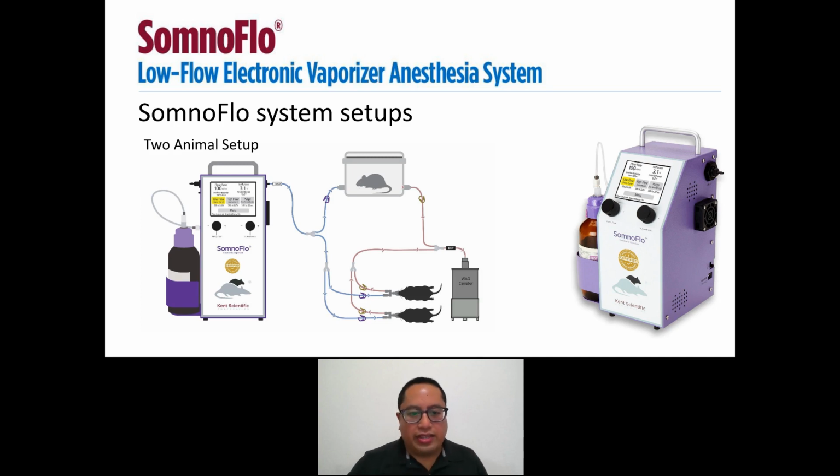Oh, yep, definitely. So the main difference between using the ambient air and the compressed gas is that if you're doing longer procedures, let's say more than 3-4 hours, the SpO2 levels might be dropping, and so using a compressed gas such as oxygen will help supplement that for your longer surgeries. Otherwise, for shorter surgeries, there really is no difference between using either ambient air or compressed gas. I've run into customers who use compressed gas for short-term procedures. They work. I have other customers who stay with ambient air for those shorter procedures as well, and everything is going fine for them too.